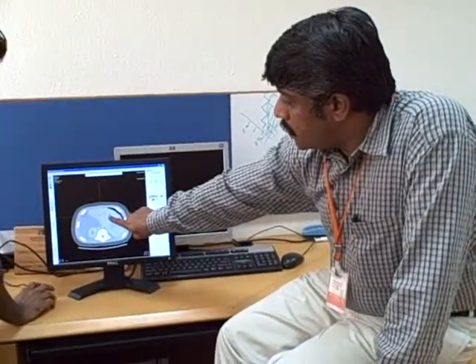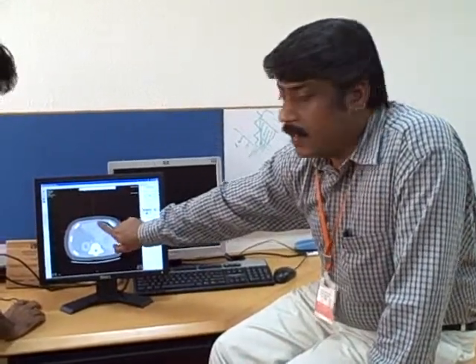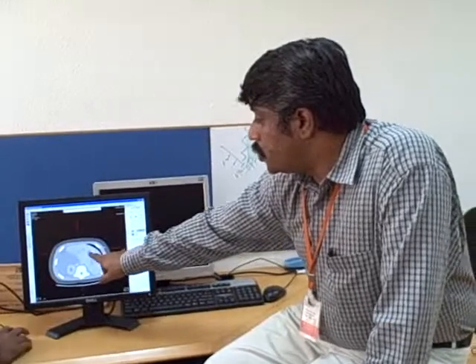So the doctor, using this red circle, has marked that he needs to get to this point. And he picks a point on the skin surface, which is called the entry point, depending on which is the best path that he can identify. If there is a blood vessel here, he wouldn't choose this. Probably he would choose something like this. So you can get an angulation. It's not just straight insertion. He can choose the path depending on whether there is a critical organ in the path, or a bony structure, or anything else that he should not be puncturing, he can avoid those and plan. We allow them to plan.